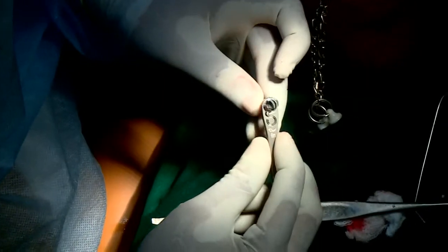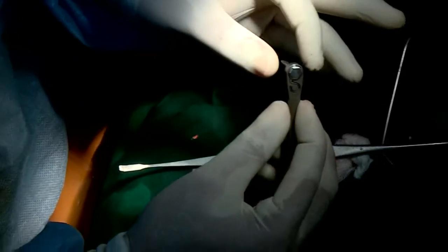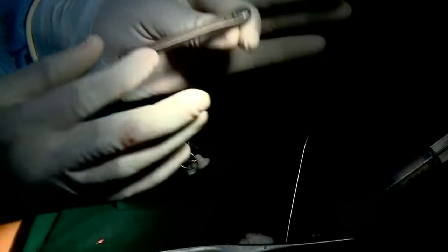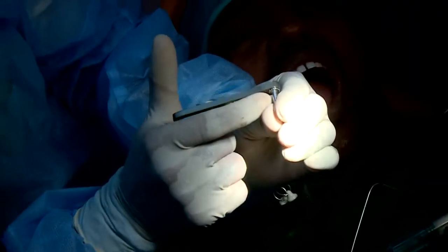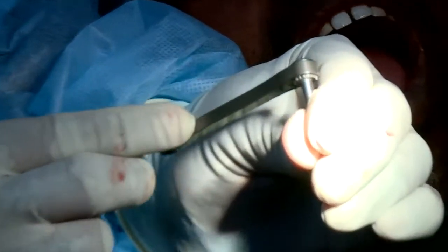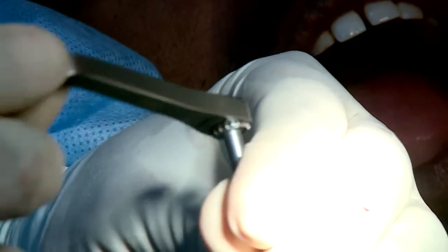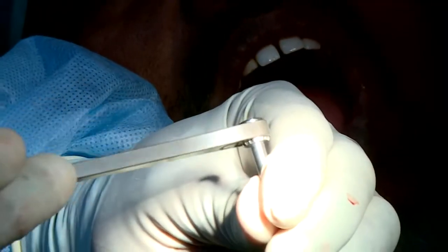So here we are talking about in. All I have to do is slot this in. When I slot it, I am going to hold this driver together, and when I do it, you can see that it is actually turning. Now I will show you here. When I am turning it, in other words, when I am tightening it, it is turning. But when I am reversing it, it is not turning. That's the ratchet. It's a one-way thing.